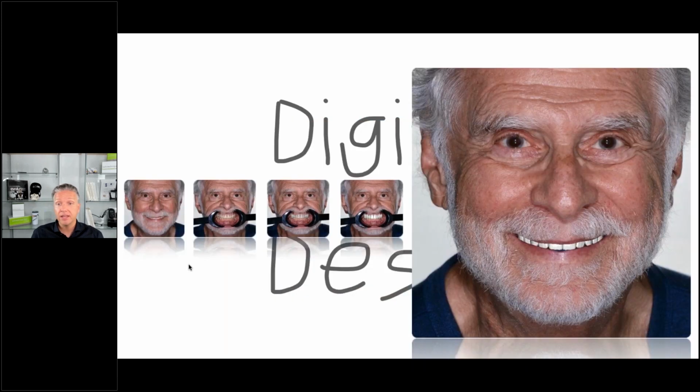So we see here the smile and the retracted view, and then we put the molds digitally into that view, and we can refine that and send the patient our proposal. We say, hey, that could be your smile. Do you like that? He saw how everything built up, and he said, that's exactly what I want. So can you do that for me?